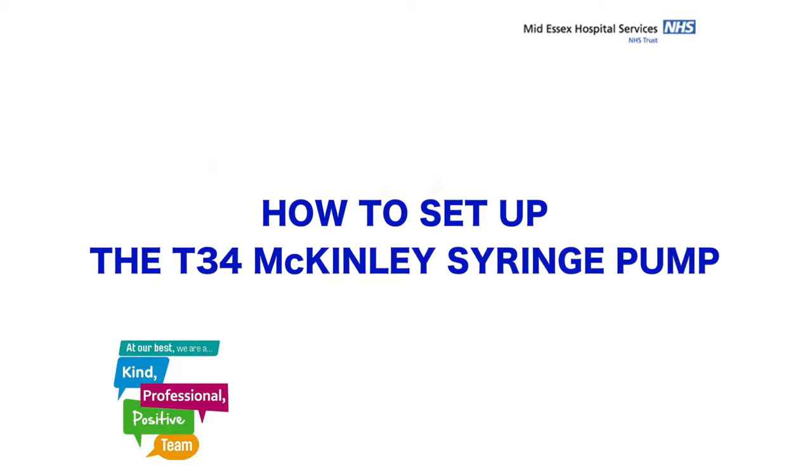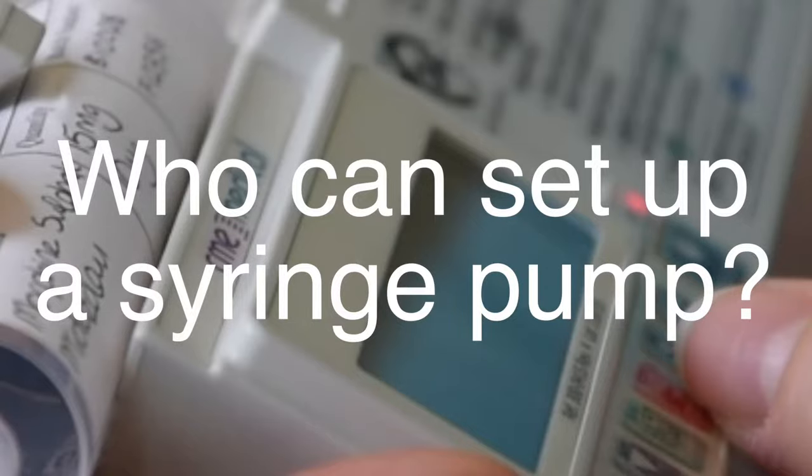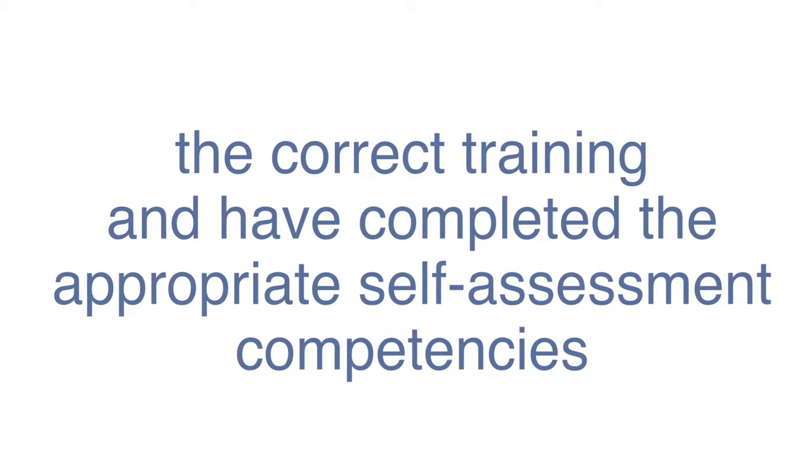How to set up the T34 McKinley syringe pump. Who can set up a syringe pump? Any trained registered nurse can set up a syringe pump, providing they have received the correct training and have completed the appropriate self-assessment competencies. These can be found on the intranet.